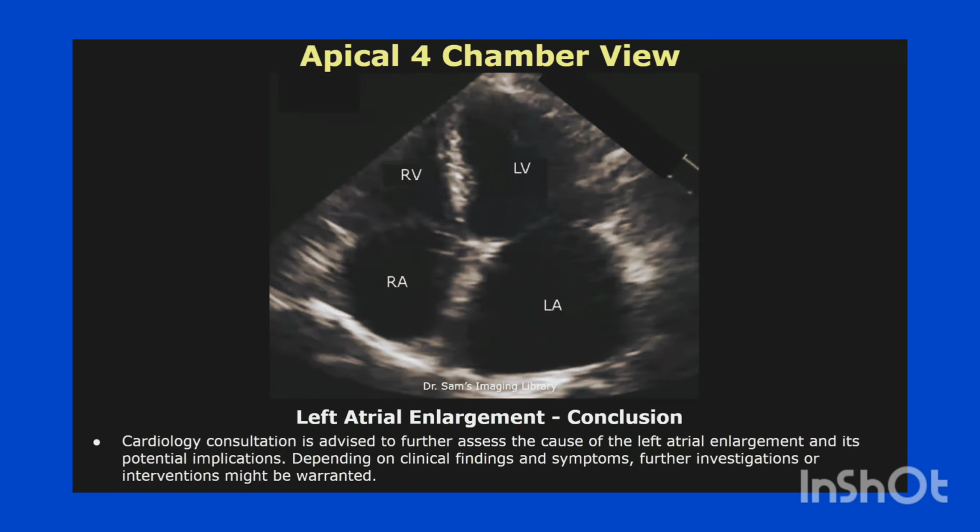Cardiology consultation is advised to further assess the cause of the left atrial enlargement and its potential implications. Depending on clinical findings and symptoms, further investigations or interventions might be warranted.